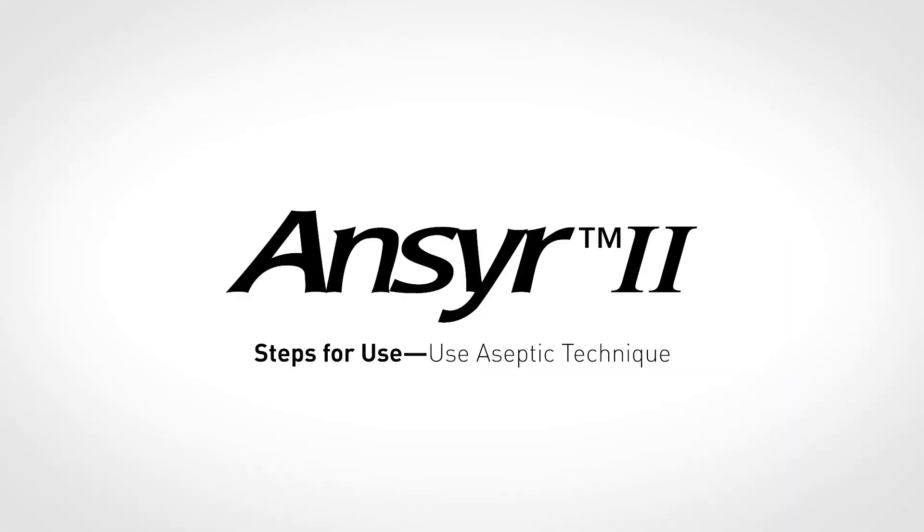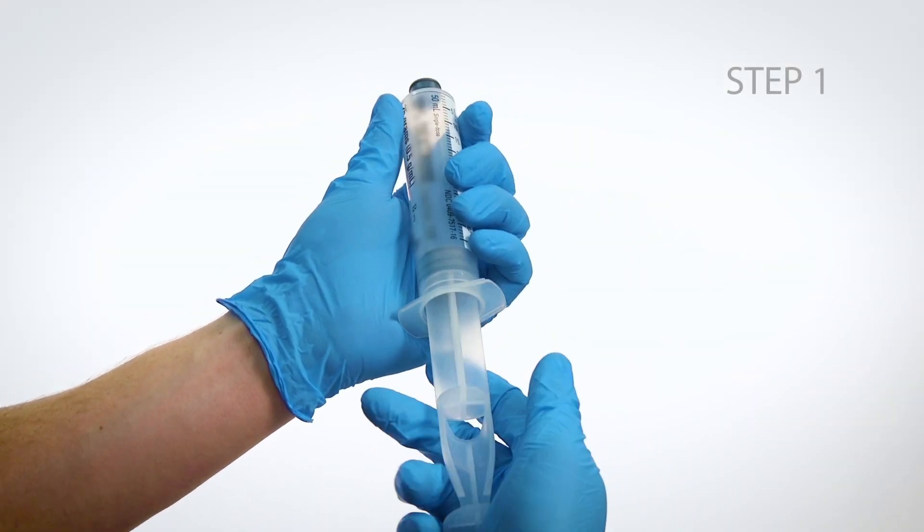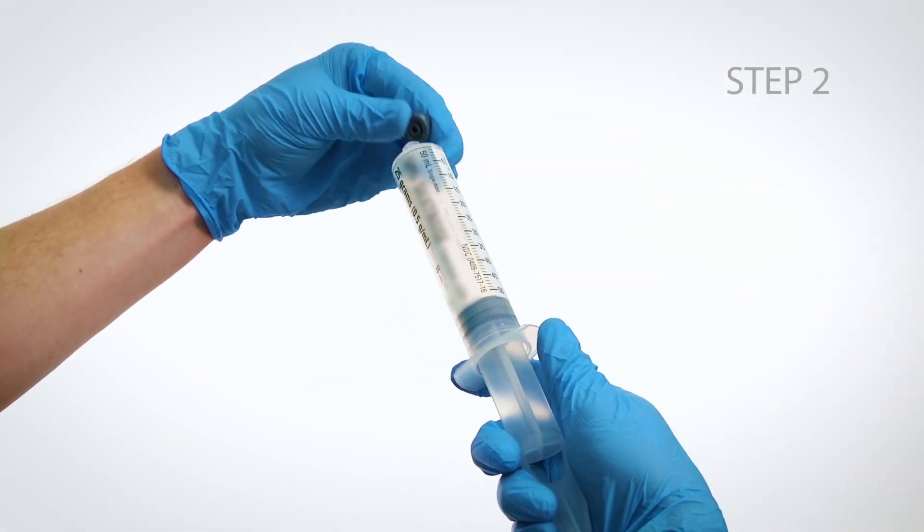Now let's take a look at the Answer 2 — a two-piece 50-milliliter syringe stored side-by-side within the package. Steps for use. Use aseptic technique. Step 1: Assemble plunger to syringe. Step 2: Remove the Luer lock cover.